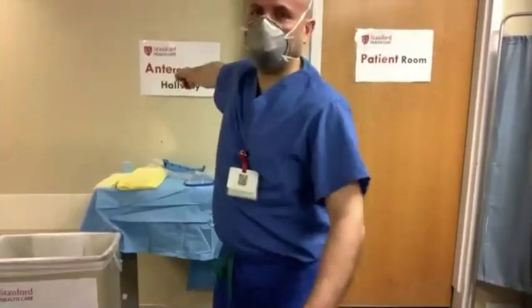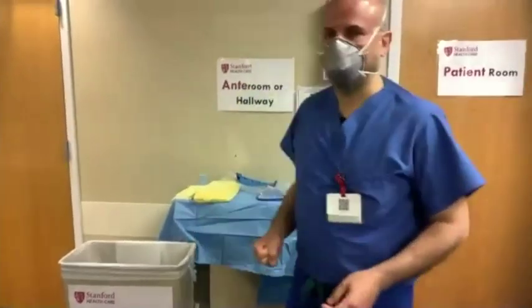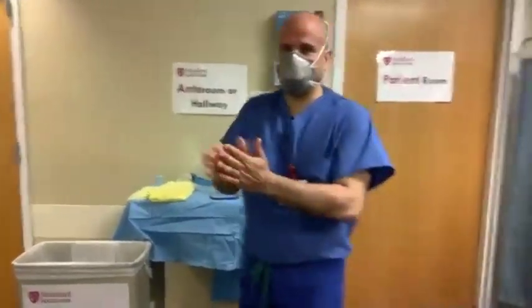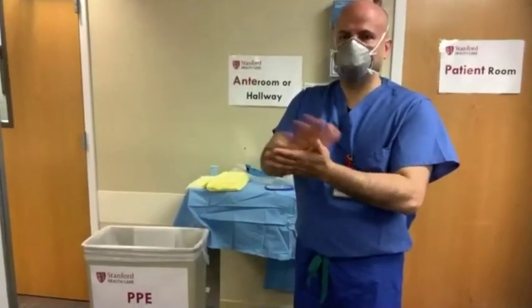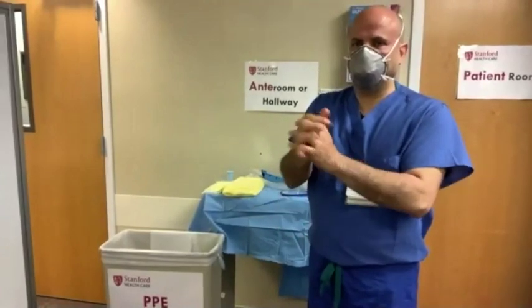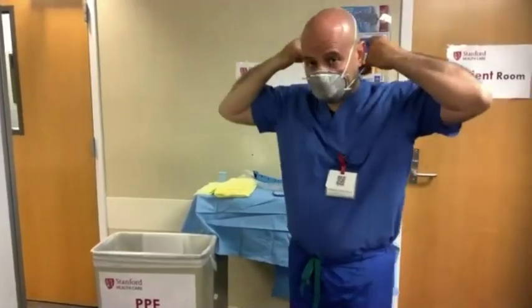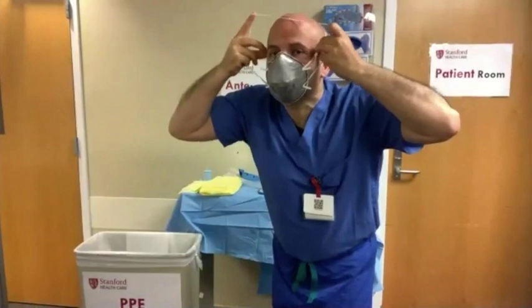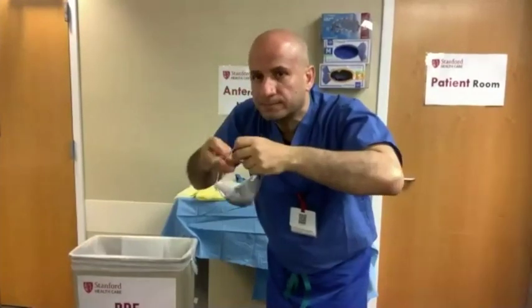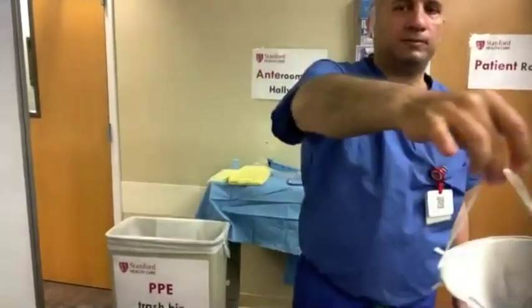Now in the anteroom, the final step is to perform hand hygiene once more. Then doff your N95 mask. To do that, remove the mask without touching the exterior part. Assume the sniffing position once more, removing one strap at a time — starting with the bottom strap, then the top strap. Grasp the straps, pull them from the back of your head, and dispose of the mask in a biohazard bin, making sure the mask drops in first.